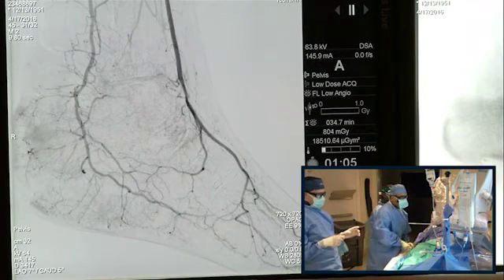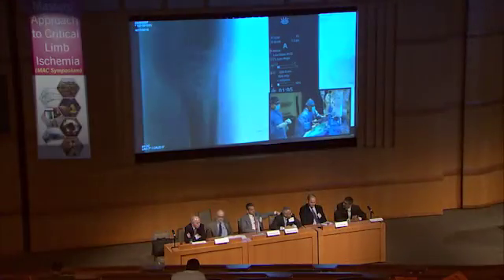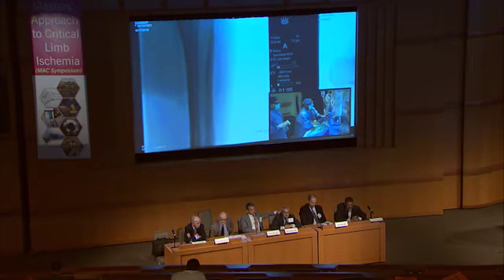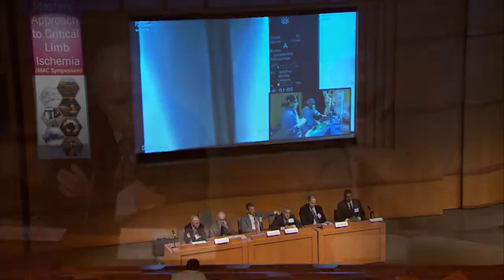This is an excellent result right now, Mehdi, and my vote, if I may just say, is just stop and go for the SFA right now. That's my vote. No, the PT is not yet perfect. There's still at least 70% stenosis remaining below the area which was treated.